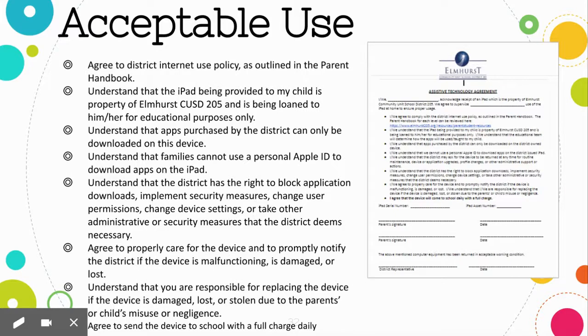We ask that you not use a personal Apple ID to download any apps onto the device. We ask that you properly care for the device and inform the district if it's lost or damaged. We ask that you not take the device to any places where it could easily get damaged, like the beach or the pool. We can work with you to create some low-tech supports for your child if there are places that you go frequently that maybe the device is not appropriate.